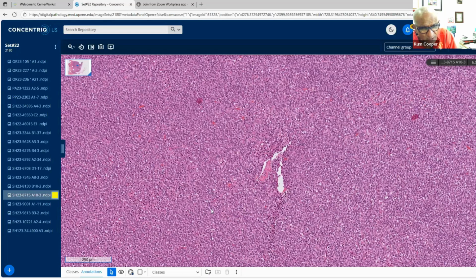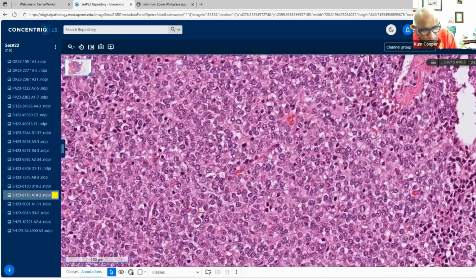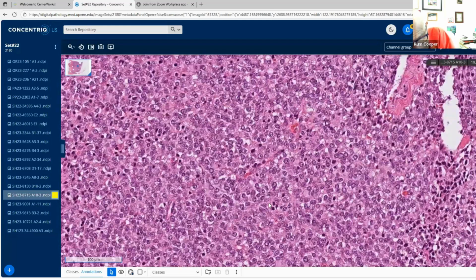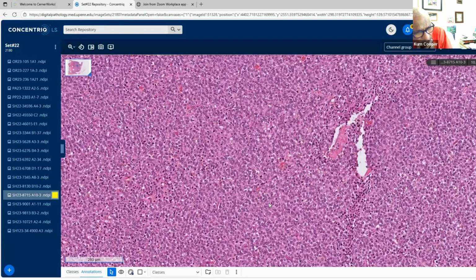Synovial, you can get a round cell synovial. This one has too much cytoplasm, but I've seen synovials with abundant cytoplasm. So that would be a good thought. Age would fit with that. And again, if you have the antibody to the SYT-SSX, that's useful. They work very well. Otherwise, if you have FISH and you can probe for SYT, that's the other way around it.